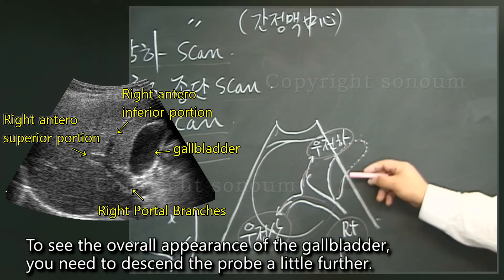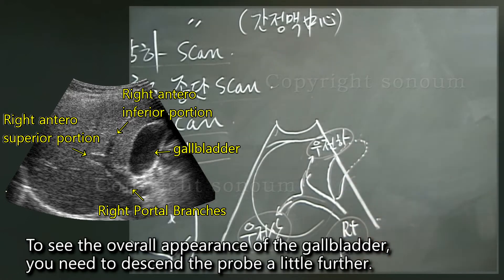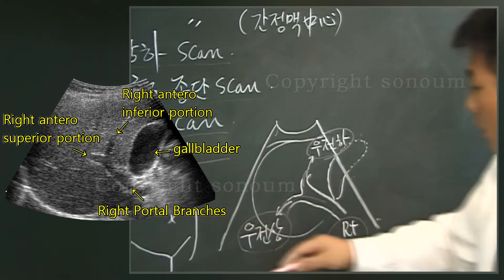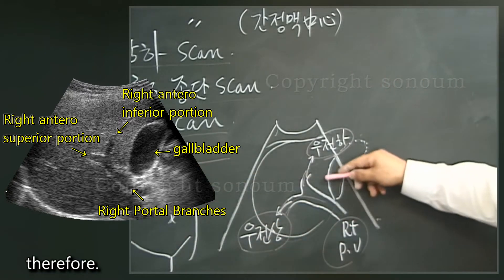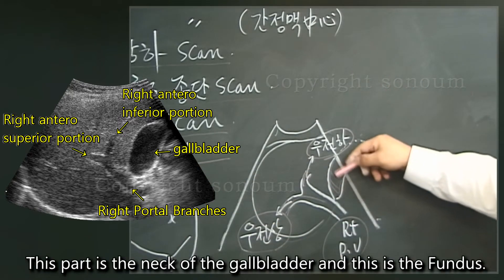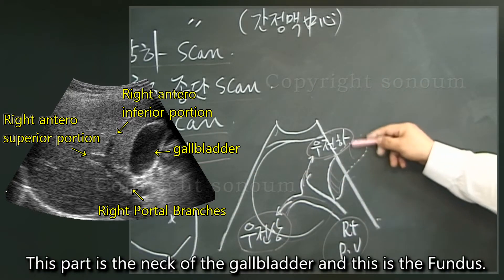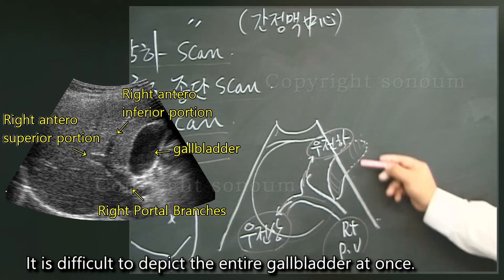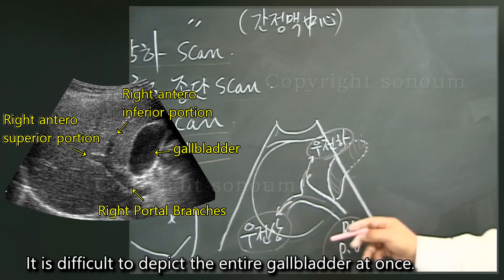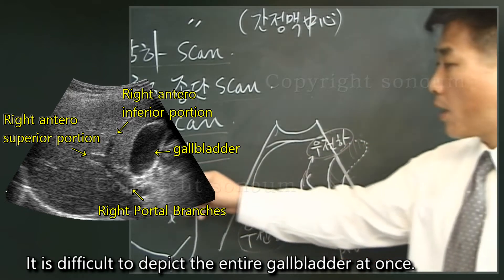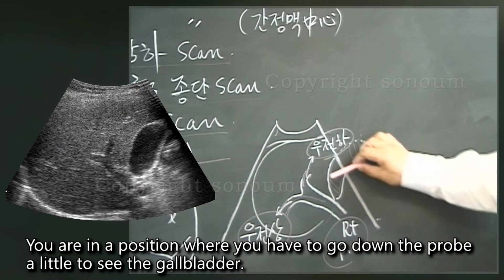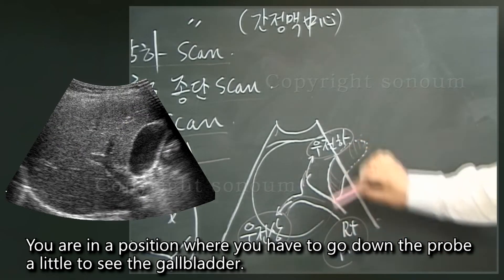To see the overall appearance of the gallbladder, you need to descend the probe a little further. This part is the neck of the gallbladder and this is the fundus. It is difficult to depict the entire gallbladder at once — you have to lower the probe a little to see the full gallbladder.